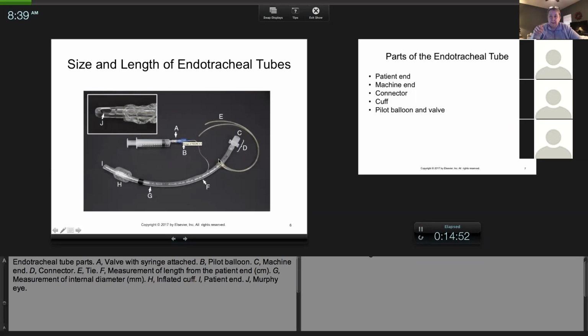When you put it in the patient, you're going to have to secure it to their jaw. Some clinics use IV tubing. When an animal's done with surgery, you can disconnect the IV line, throw away the fluid bag, and cut the IV line in pieces, and some people use that as a tie.